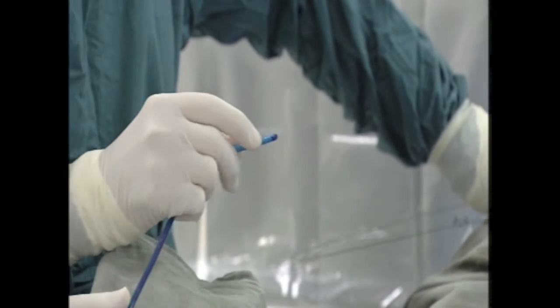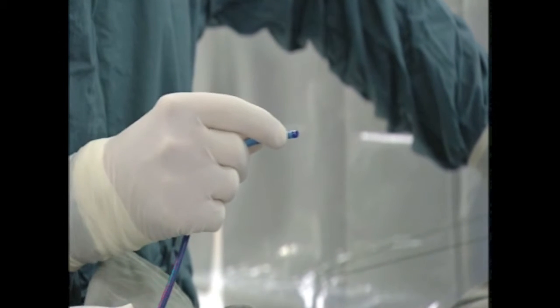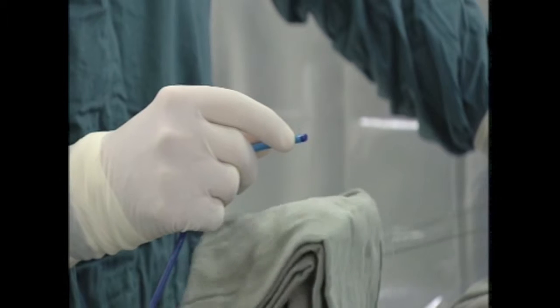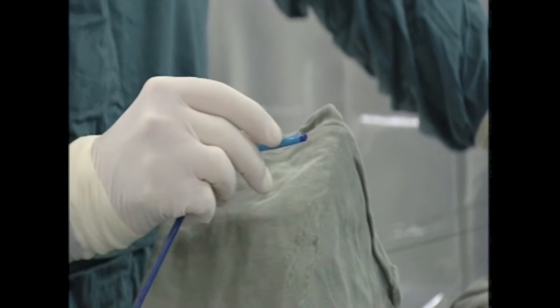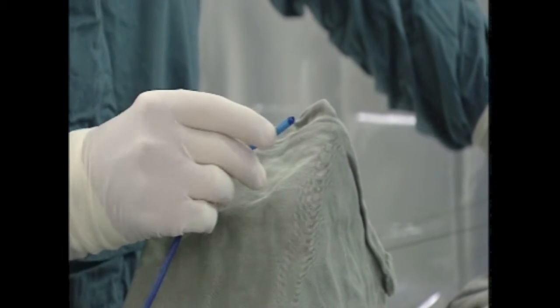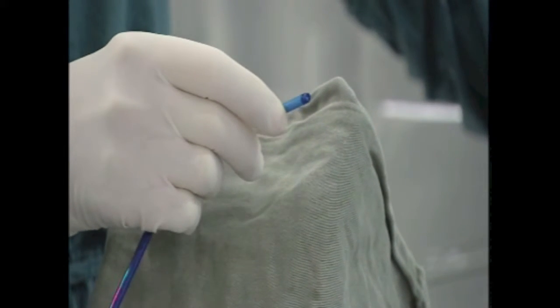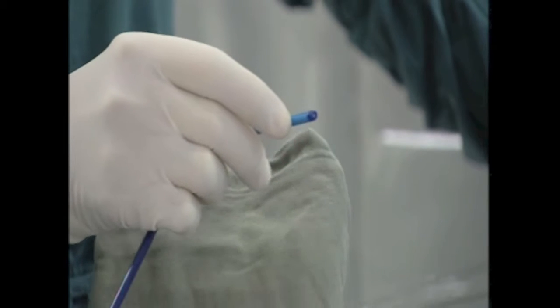What you can also see, and this is different from the ACP sheath, is that there are little side holes at the distal end which facilitate aspiration and injection of contrast. So it happens rarely that you have obstruction of the end hole, as it sometimes happens with the St. Jude sheath. Okay, can you advance the dilator, please?